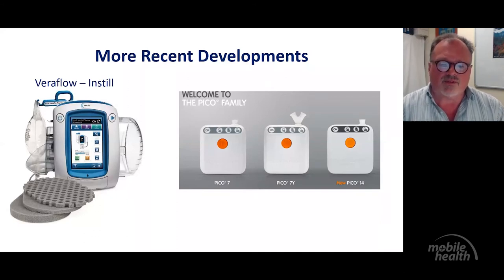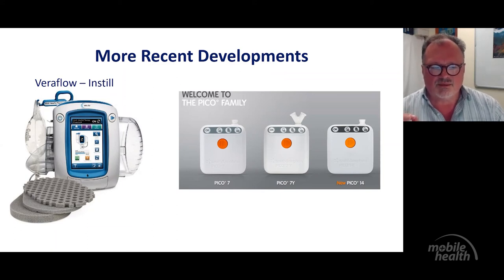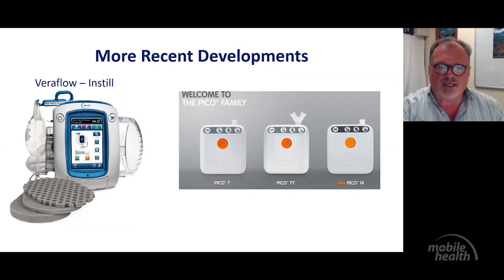Although we only use it for hard to heal wounds, we wouldn't combine an acute surgical dehiscence with a lower leg ulcer wound which has been in place for 6 months. So the origin of the wound needs to be the same or similar. And then we use Y-pieces where you can use two dressings with one machine. So that's pretty cool. I haven't seen that one here.